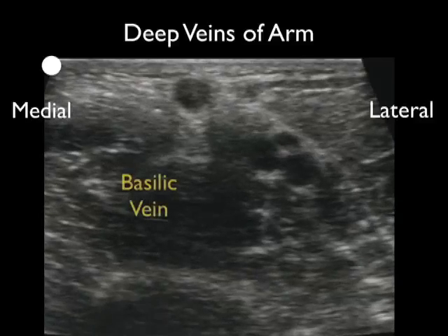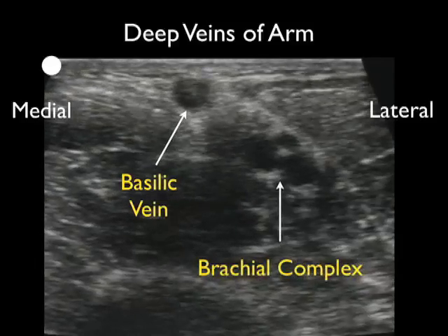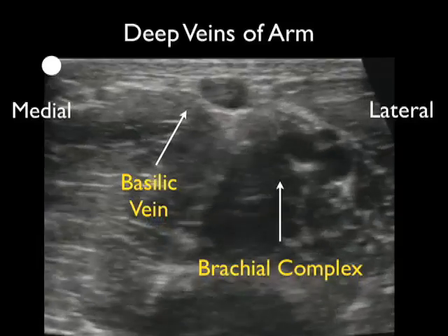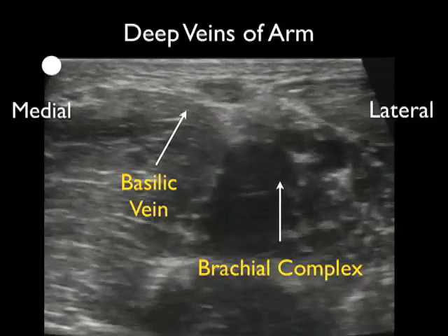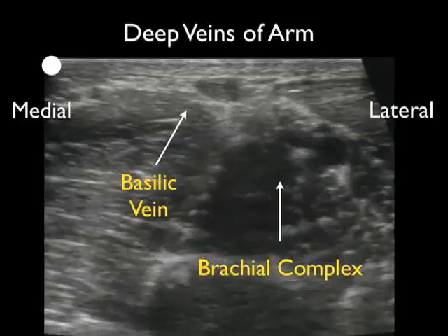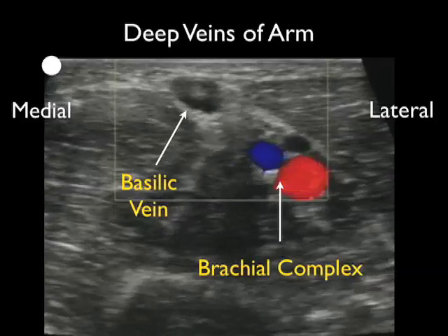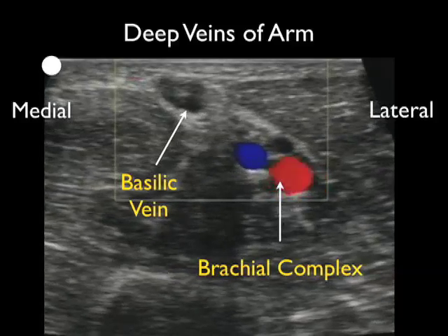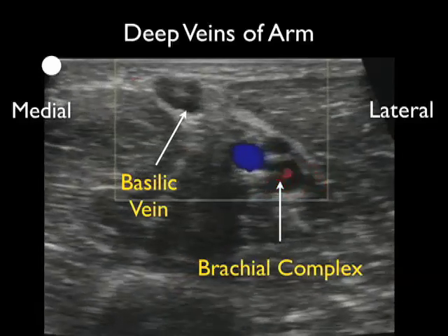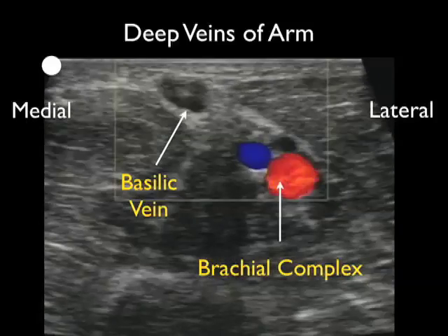Here's a different patient. Again, we're looking at the relation of the basilic vein to the brachial complex — medial is to the left and lateral is to the right. We see the superficial basilic vein and the deeper brachial complex. Notice we apply pressure and all of the venous structures — the basilic vein and the deep brachial veins — all compress completely, helping us differentiate venous from arterial structures. Applying Doppler flow, we can differentiate the brachial artery by its pulsations consistent with arterial flow, and note the lack of significant flow within the venous structures, specifically the basilic vein.